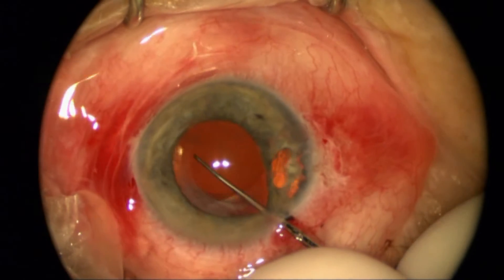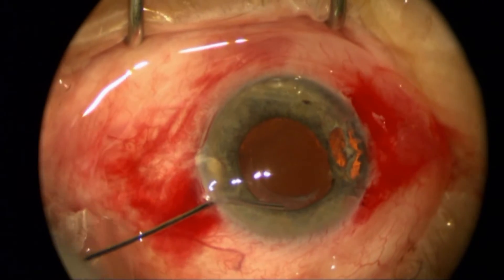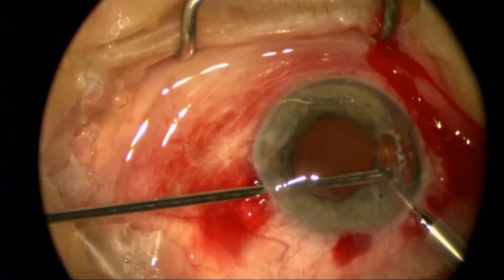I've got to get this other loop out of that cocooned scarring, rotate it around, and I finally got excellent centration and got that bag completely open.